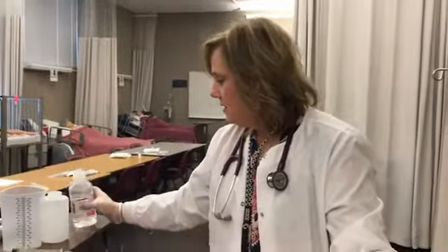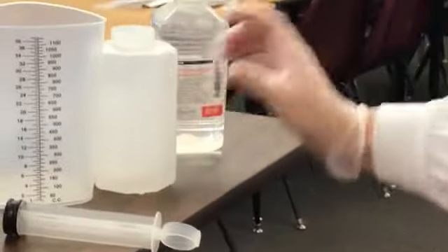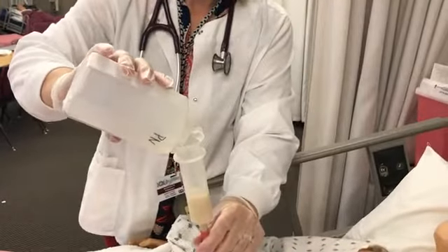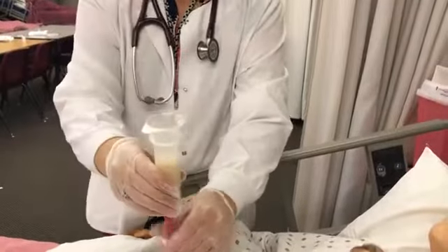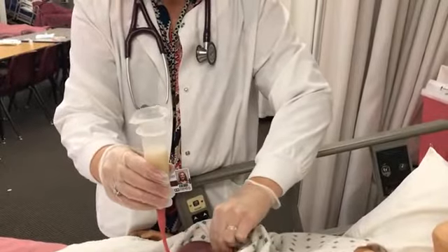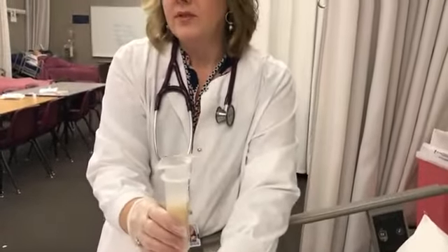So next, the doctor says to flush with 50 cc's after the feeding. So now we'll flush the rest. And that's going kind of slow as well.